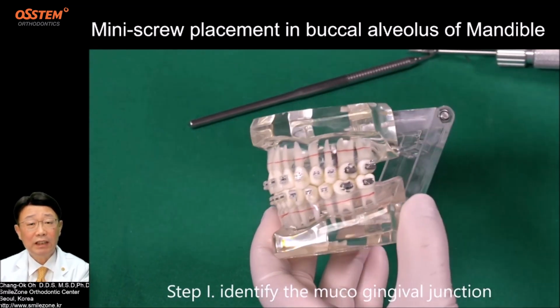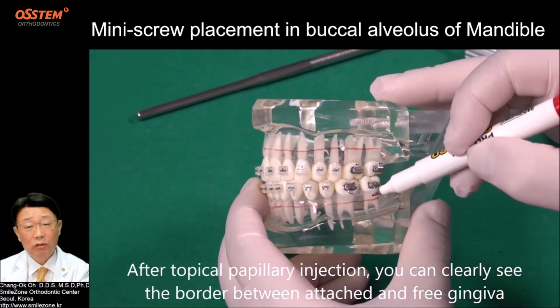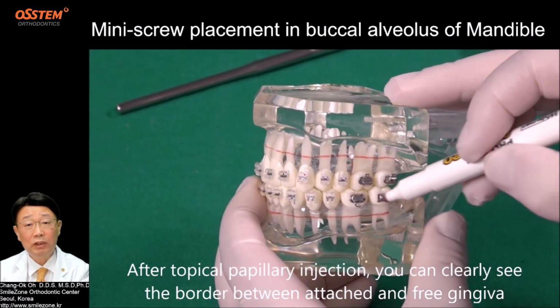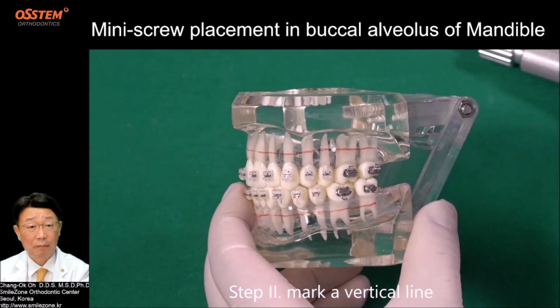Step 1. Identify the mucogingival junction. After topical papillary injection, you can clearly see the border between attached and free gingiva. That is the mucogingival junction.